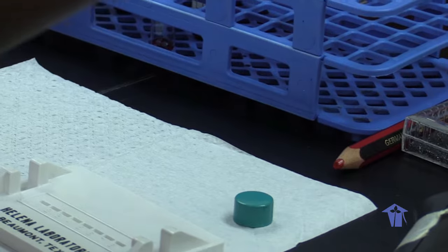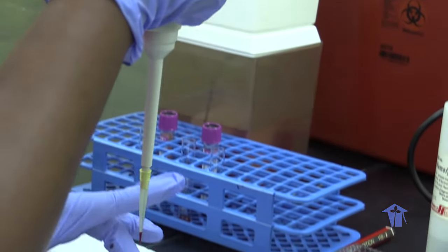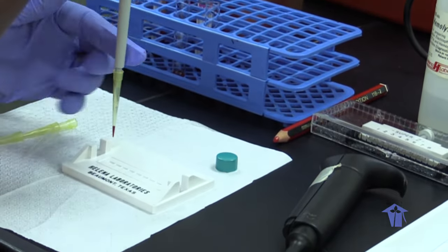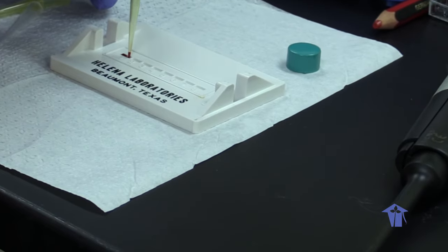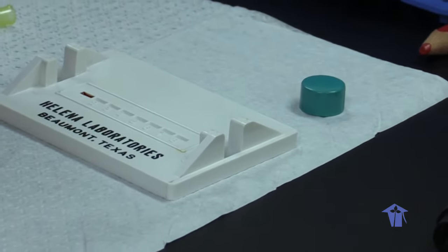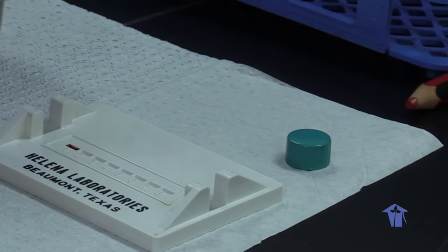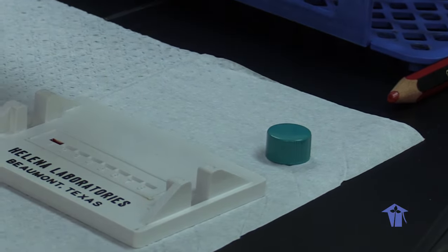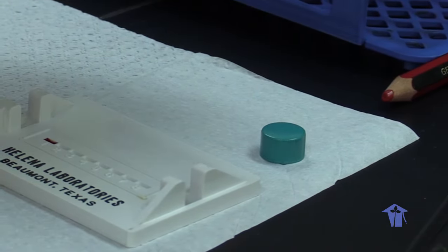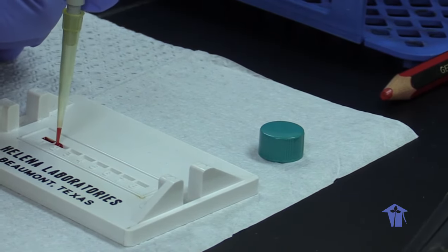So we're going to put 5 microliters of the sample into the wells, so we can pay close attention to the technique. We dispense the sample on one end of the well and just move our pipette around like that. And do it again. So control in position 1. We're going to use a sample. Dispense.